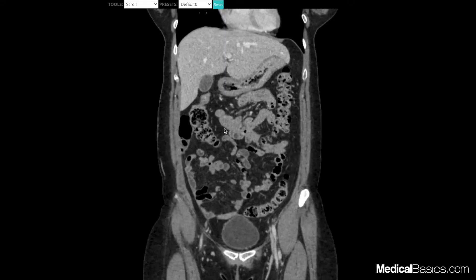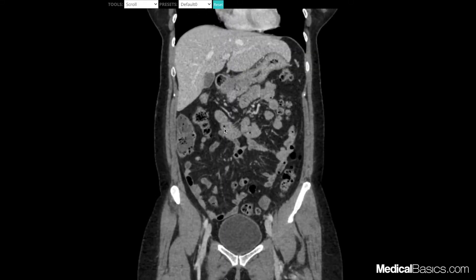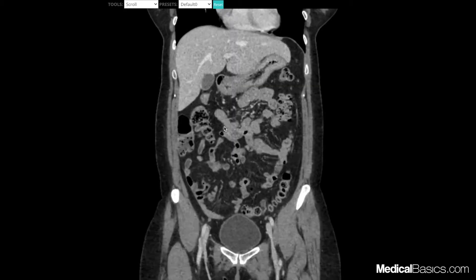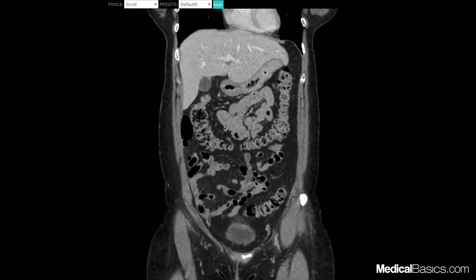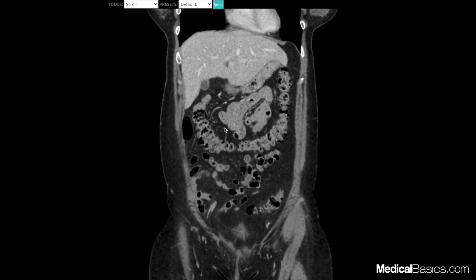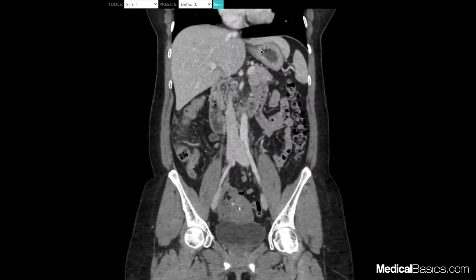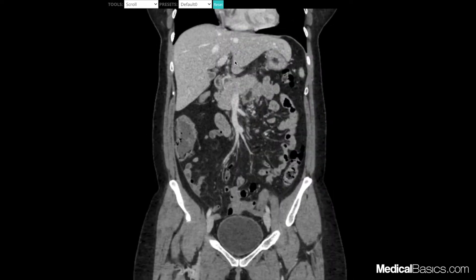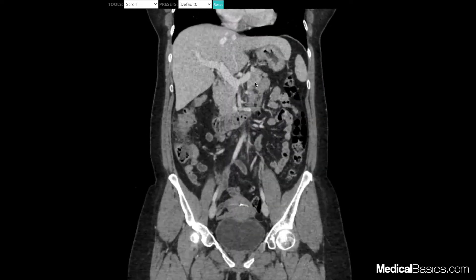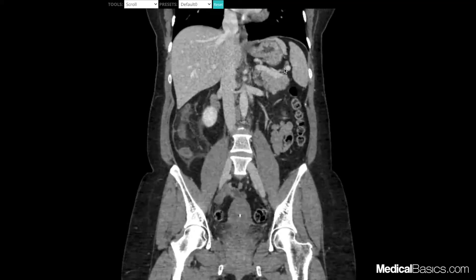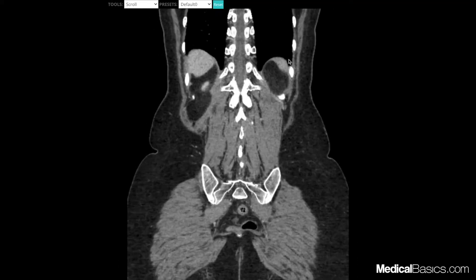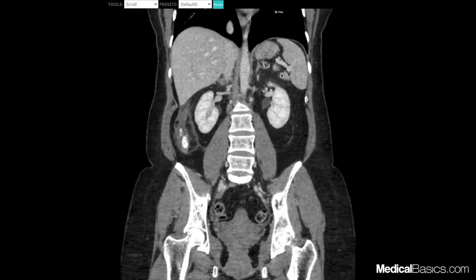The coronal image is one clinicians are much more comfortable with because this is how you look at a KUB or a chest x-ray. It's the plane that you're more familiar with, rather than an axial scan, which requires a lot of imagination and rotation in your head. So the first thing is just looking at the major organs. This is going to be our liver, this right here is going to be our pancreas, and this is going to be our spleen.